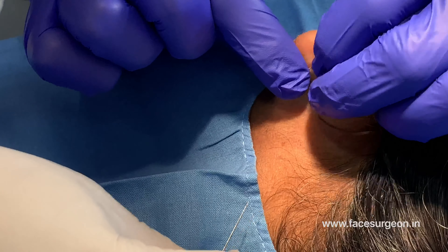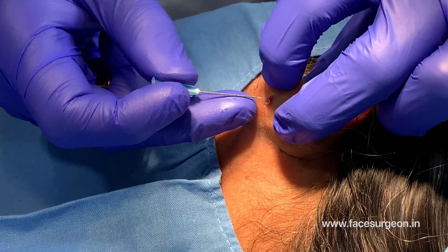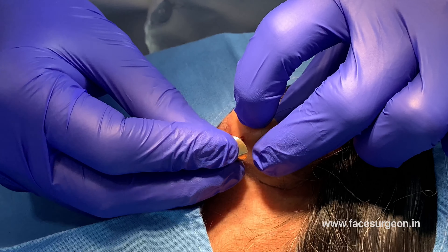I've got one needle in. Yeah, pull it out — hold on to this one please.